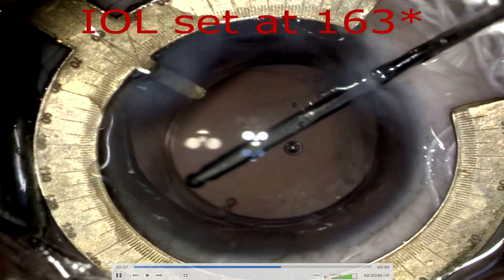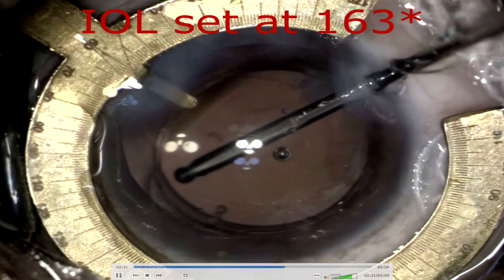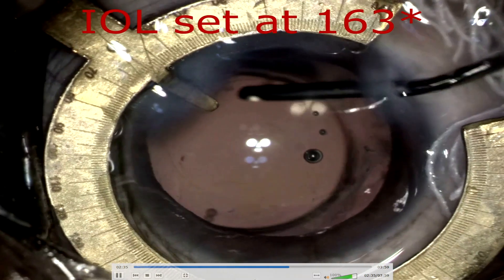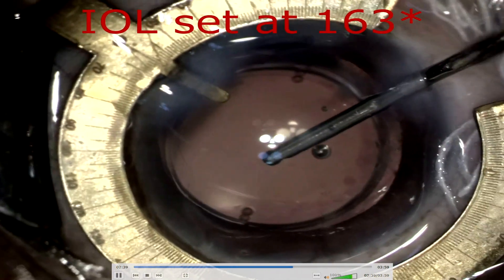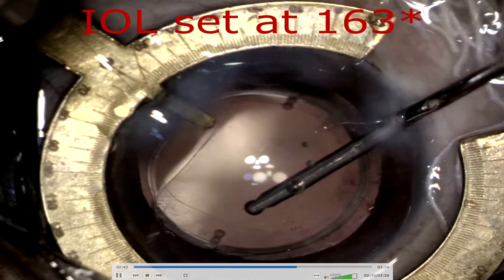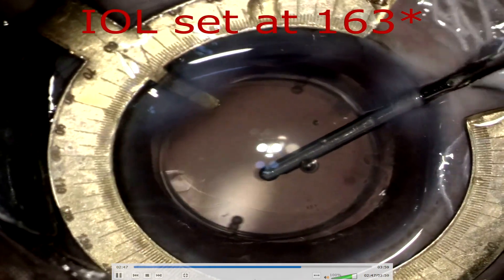The protractor ring is now set 360 degrees parallel to the limbus. The globe is stabilized and we can maneuver the globe as well. With the help of an irrigating cannula, the IOL can be easily maneuvered and easily rotated. We can see there is a 1-degree spacing between each axis marking.